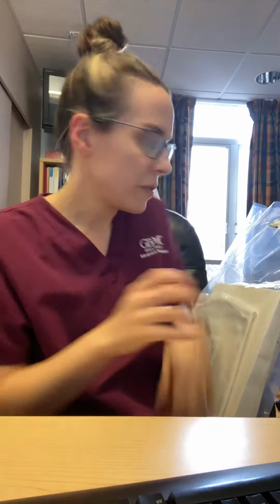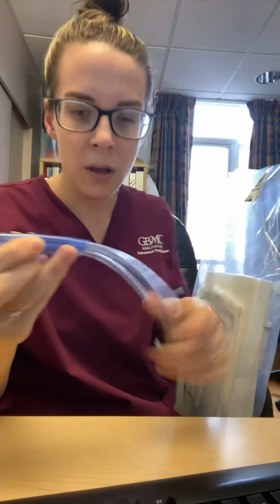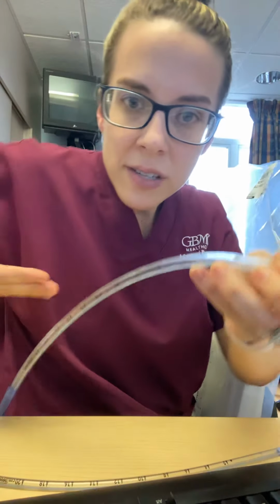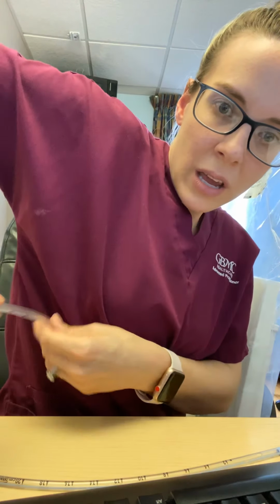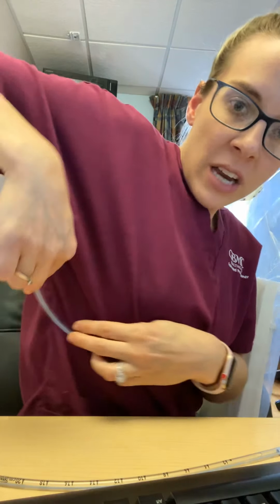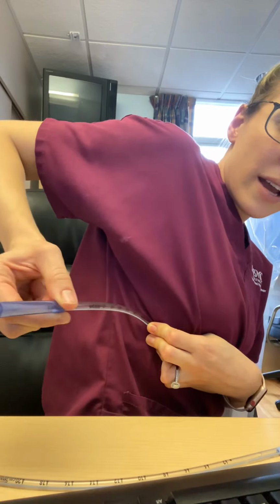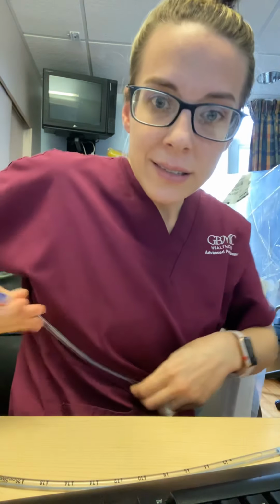Okay, so chest tube overview. I actually have some chest tubes here. These are really small, but in the OR after thoracic surgery is performed, you can kind of see these little drainage holes on the end there. So the surgeon would have just done his thoracotomy, and he inserts this tube in the hole. So when you go to see the patient, you're seeing this end of the chest tube outside of the body, and the proximal end with these drainage eyelets needs to be underneath the skin level.